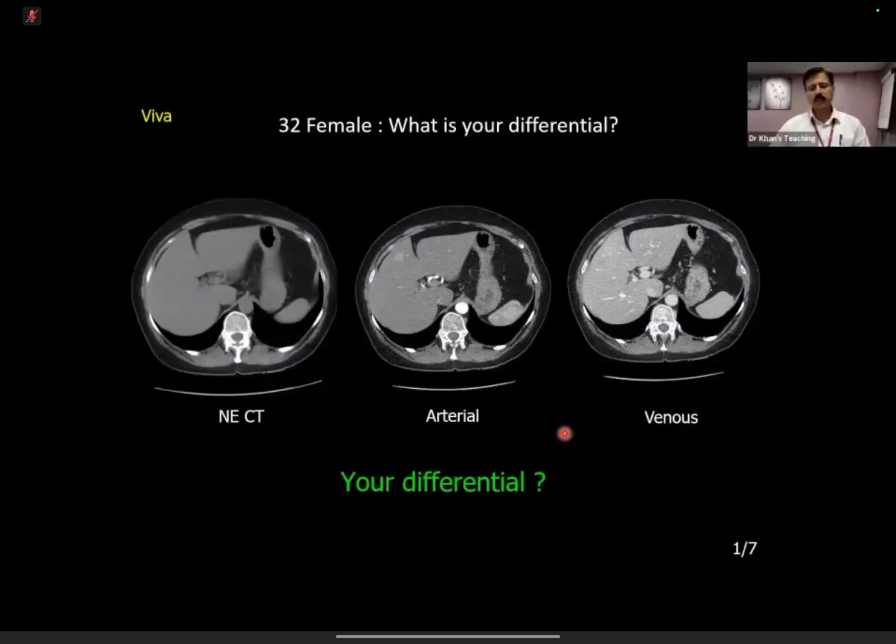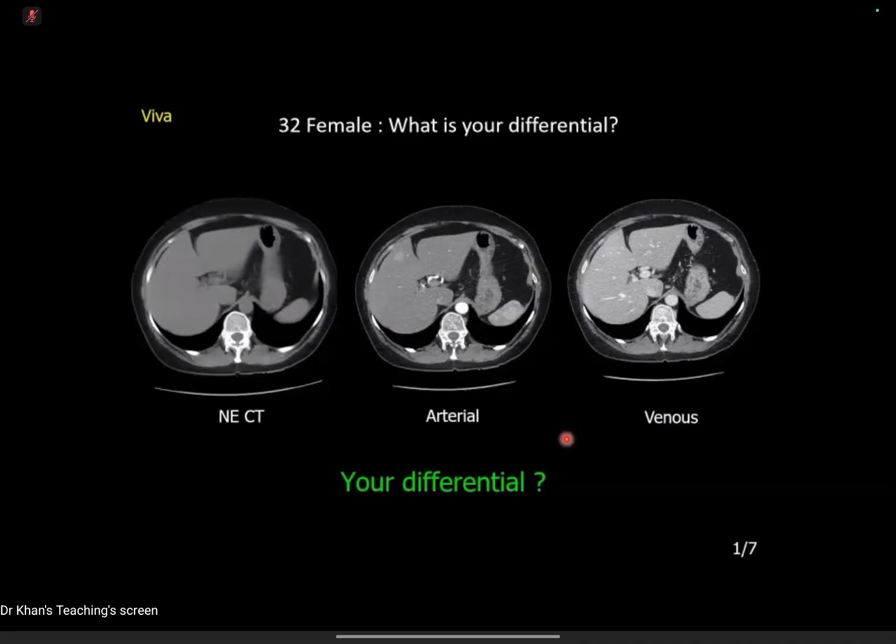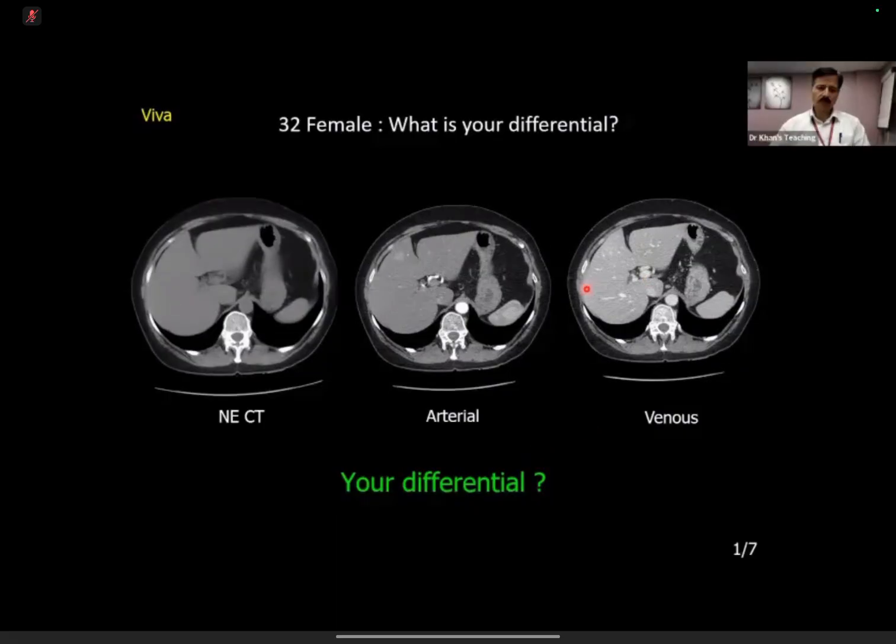So what is your concept of the word washing out? So basically, because the METs would have abnormal hepatocytes, they won't retain contrast, and there will be necrotic cells as well, so they can't retain the contrast for longer. Whereas with an FNH, it's got normal hepatocytes, it has the ability to retain it longer because the cells are functioning. Right, you are right.